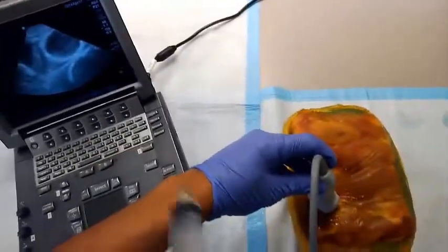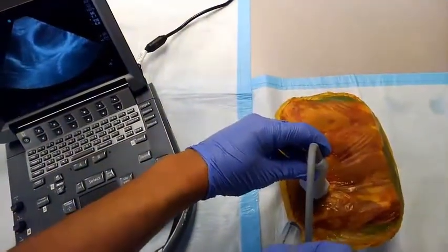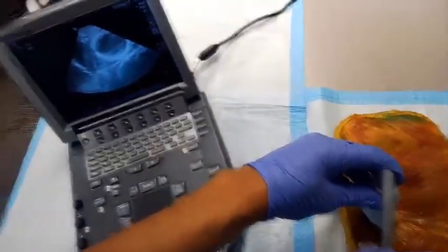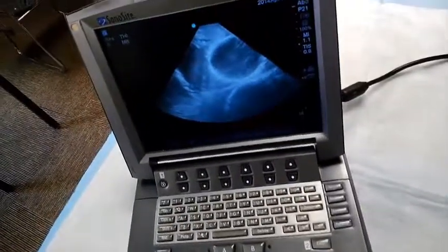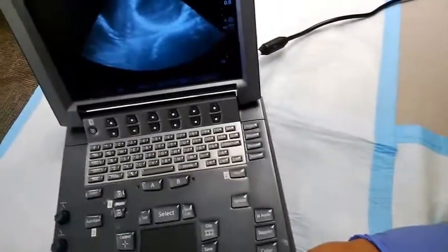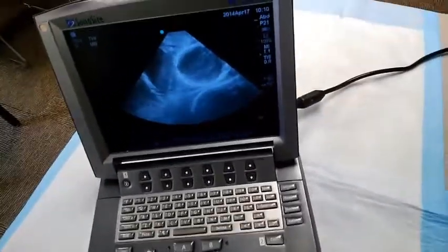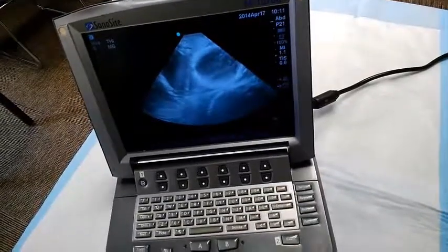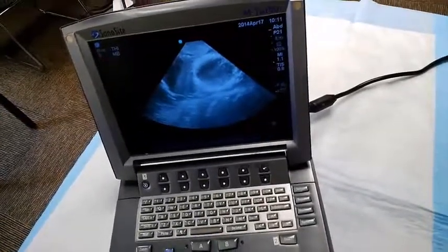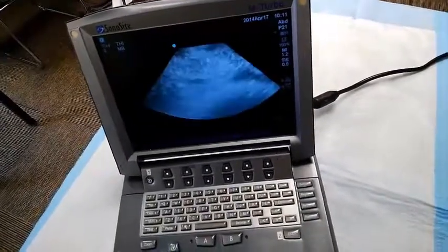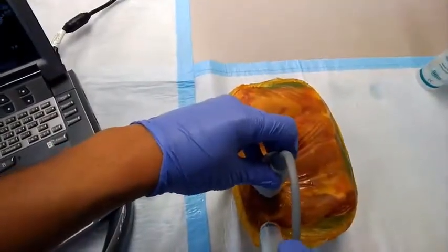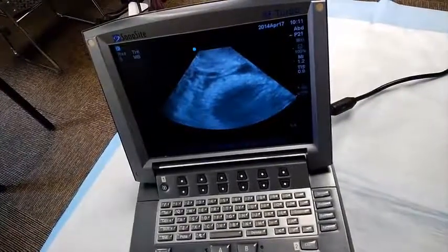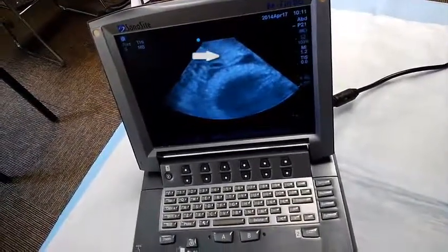I would take my needle and place it right next to that probe. As I look on the screen, I will look to see where that needle is. For demonstration purposes, I'm going to decrease the depth. Our area of interest is going to be up around here — placing my needle right next to the probe. Look at the screen — right there, I can see that needle kind of jiggling.